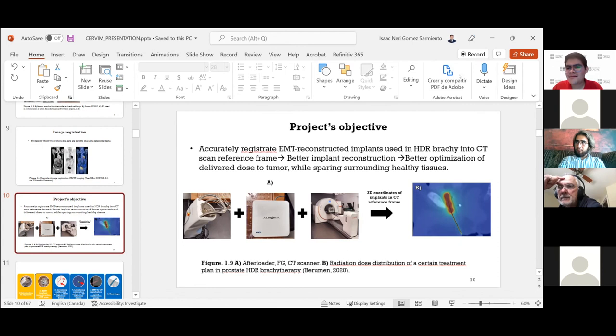I've only just arrived in Quebec. And as Isaac said, it's true that in Germany, in Erlangen, we perform a clinical study using this combined prototype afterloader, but we do it with breast cancer patients. This afterloader doesn't have an active radiation source yet. It's supposed to be like that if it becomes an actual product by Elekta. The radiation treatment is fractionated, so it splits up over 5 days with 9 irradiations.